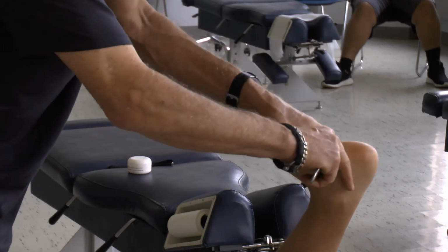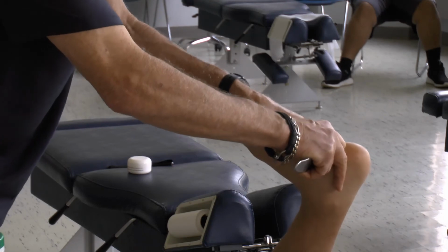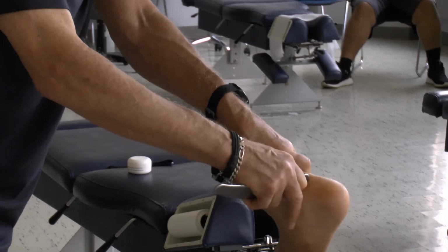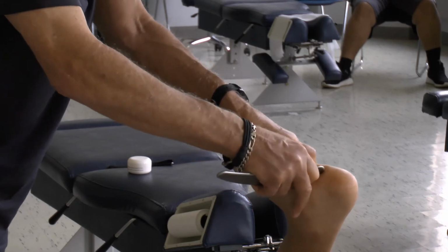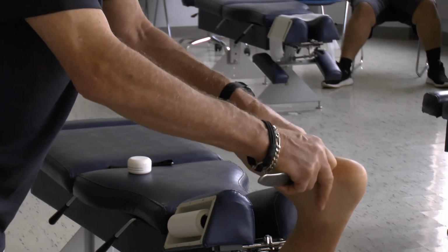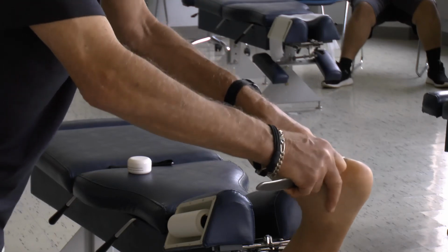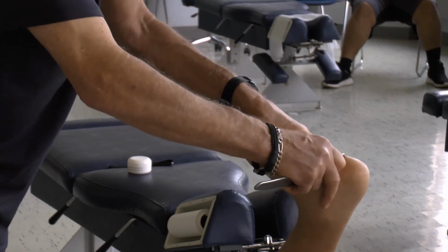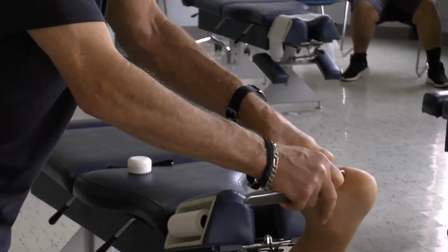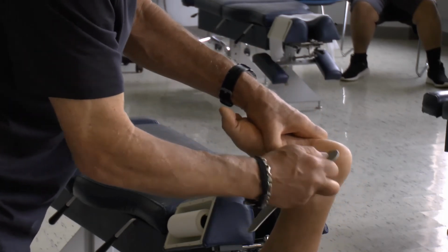And now I'm working my way right up to that medial calcaneal attachment. This is often the most sensitive area. And I'm just concentrating right in that attachment. Sometimes patients will have heel spurs here, but that's more of a symptom of the chronic state of this condition, not the reason that it's ongoing. It's again usually a degenerative, stalled, inflammatory condition. Doing okay? Yep. Okay. And I will work my way out over the heel as well.